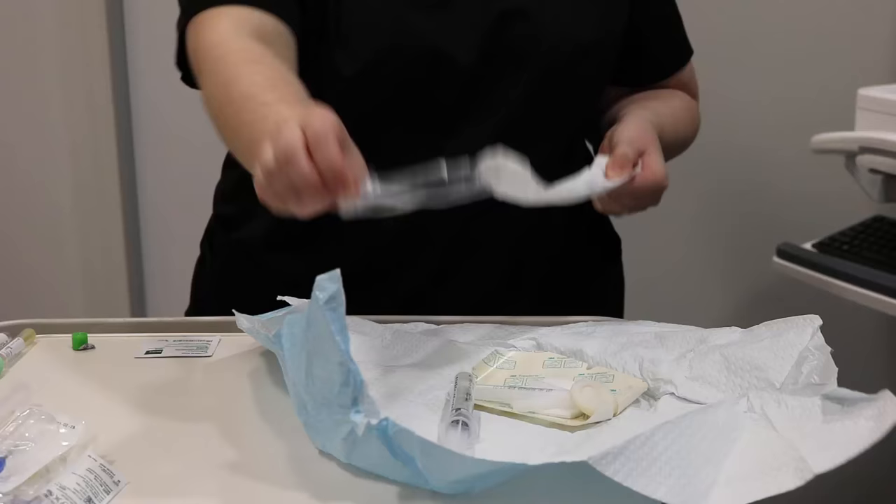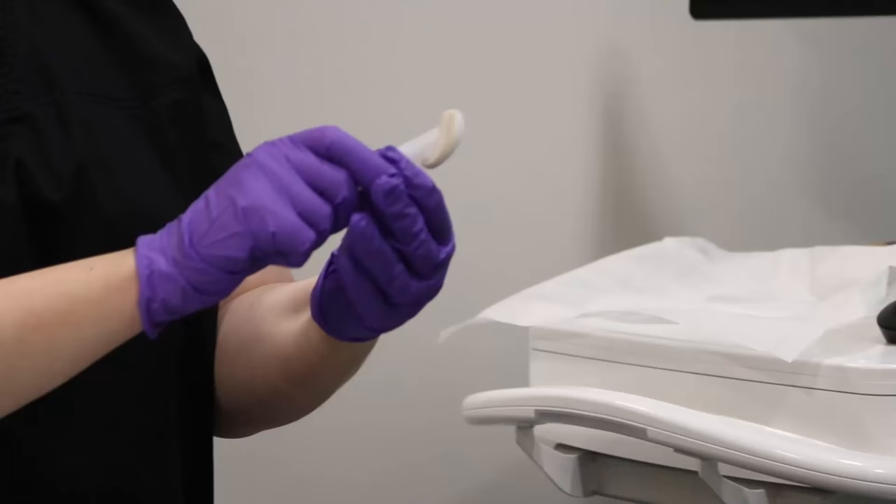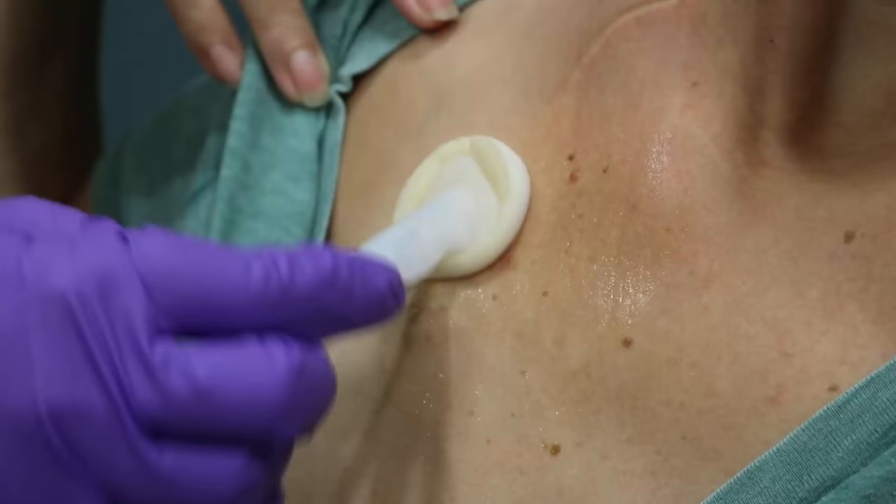This next part shows you how the port is accessed. First, the supplies are gathered and opened. The skin surface around your port will be cleaned with a special antiseptic solution. This area is cleaned for 30 seconds and then allowed to air dry. This is a sterile procedure, so if possible, you will need to turn your head in the opposite direction so you do not breathe or cough on the cleaned area.